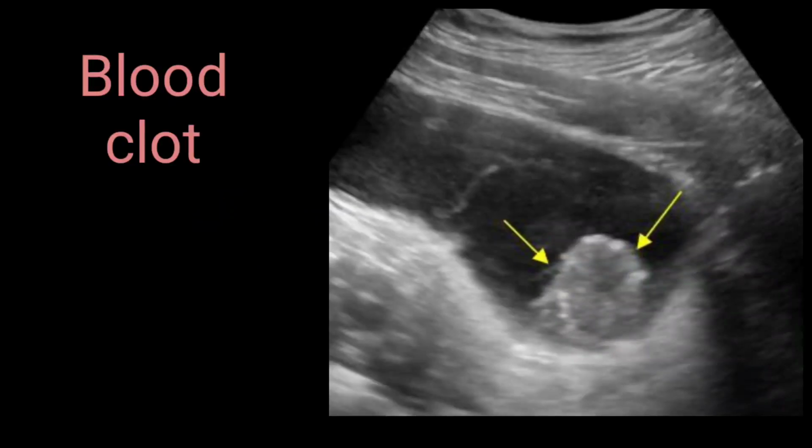On this image you can see a blood clot indicated by the yellow arrow. This pattern also looks like a mass, or you can call it a growth. Now the question is how we will differentiate a clot from a mass or growth. For such differentiation, ask the patient to roll over, or to turn to the right and left side.